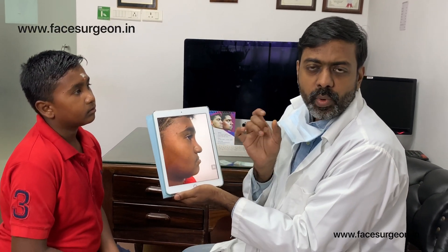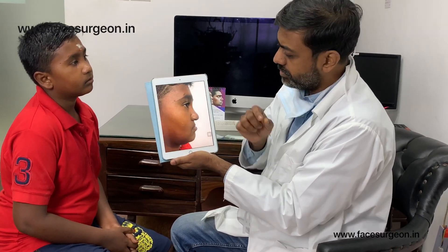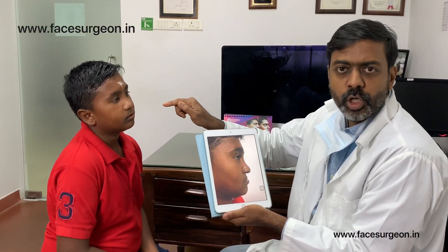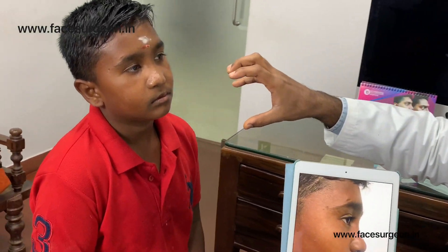The distractor was fabricated for him at our hospital. We inserted and seated it, performed the surgery, waited five days, then activated the distractor to produce new bone in his upper jaw and bring it forward. There's a lot of swelling you can already see on his face, and all this swelling is going to come down.